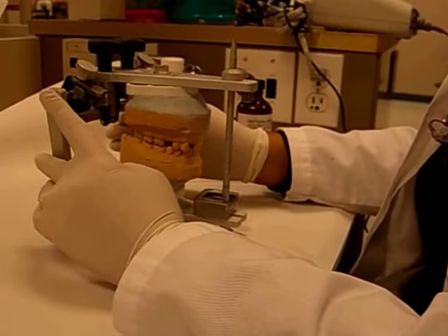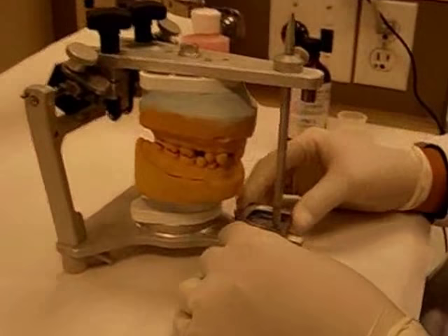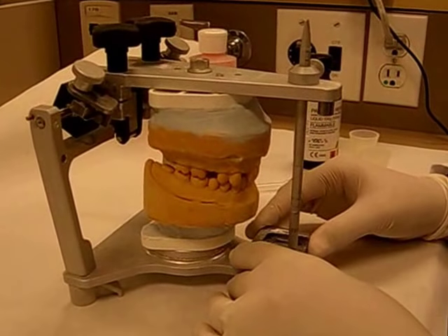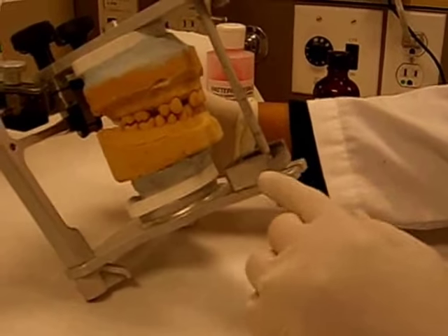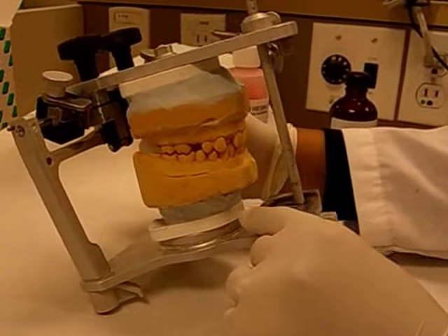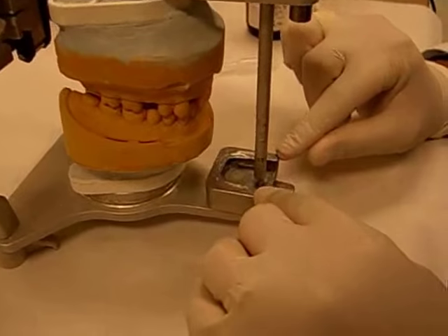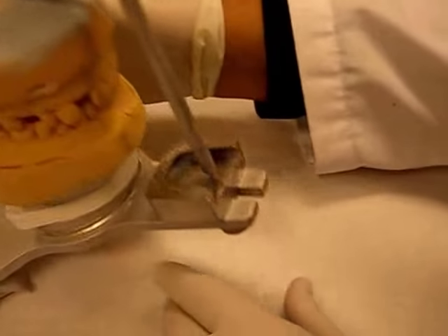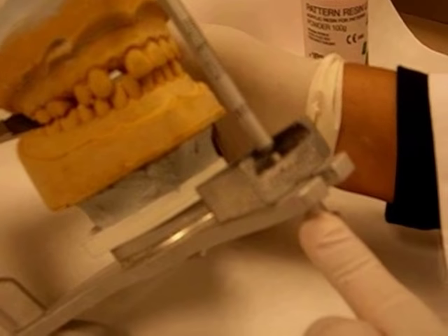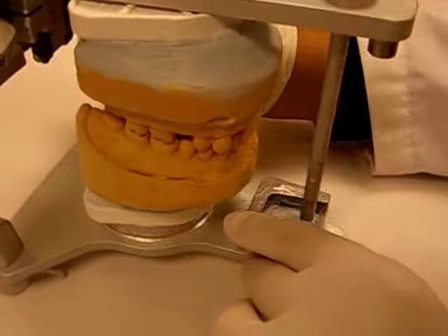I'm going to start the fabrication of the anterior custom guide table. The way the casts are articulated in maximum intercuspation, the pin is right now touching the guide table. After using Vaseline to isolate the metal interior guide table, I'm going to raise the pin two millimeters away from the table. You can see there is space on the guide table to allow enough thickness of acrylic for the fabrication of the custom interior guide table.